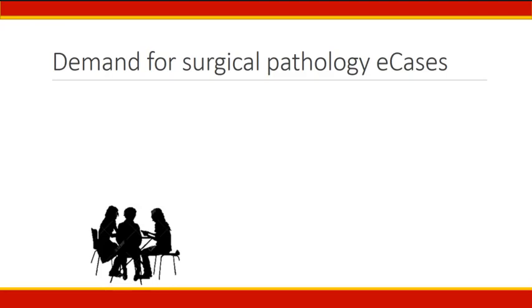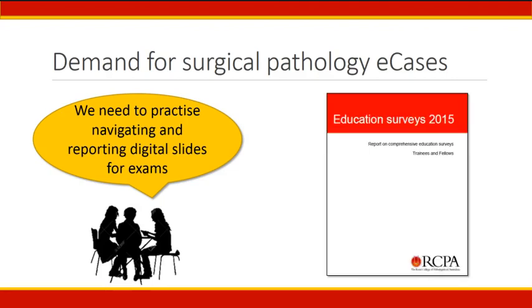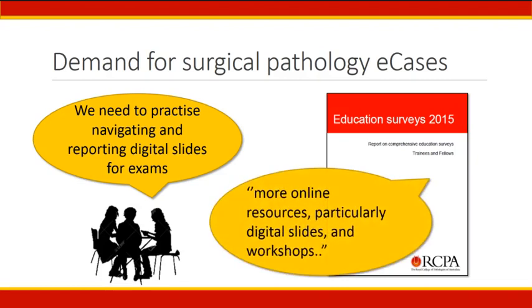Many registrars have told me, particularly at exam preparation workshops, that we need to practice navigating and reporting digital slides for the small biopsy exams. And the RCPA education survey, which we all got the opportunity to comment on, documented a demand by both fellows and registrars for more online educational resources, particularly digital slides and workshops.